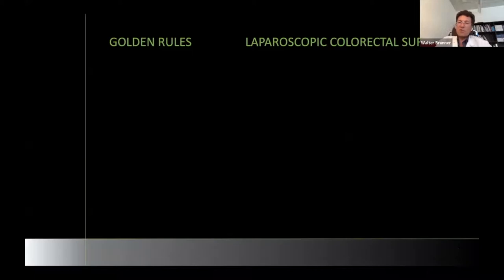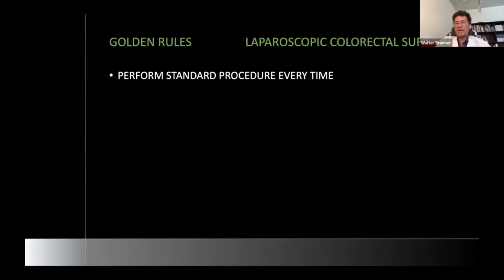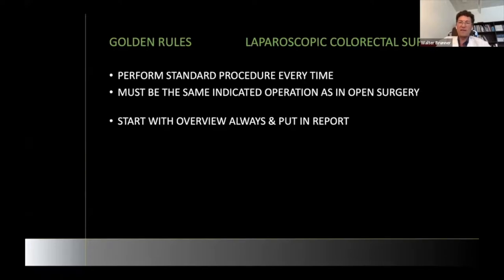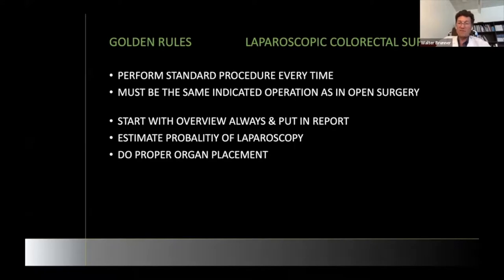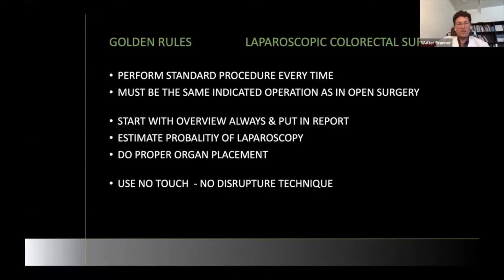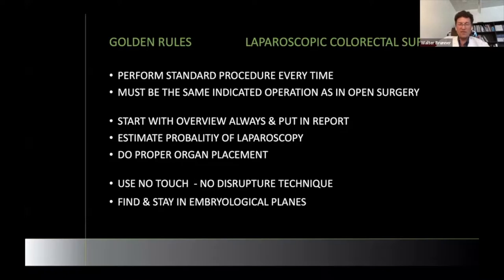Find the right planes — the dissection rules also include no-touch technique regarding the tumor. Search for landmarks and major directions. Use the peritoneum after opening, gently touching the mesocolon at the border of the peritoneum, not touching the colon itself — only the fatty tissue around it. This way you will not rupture it. Stay in the right planes, and use the non-disruption technique: don't touch the tumor, don't touch the colon, don't touch the mesocolon inside. Touch the appendices epiploicae and the border of the peritoneum — that mainly works.